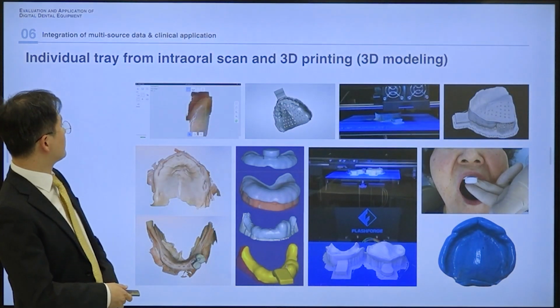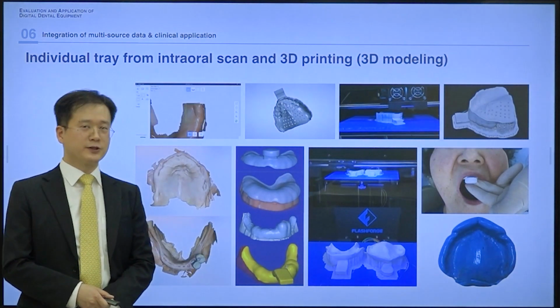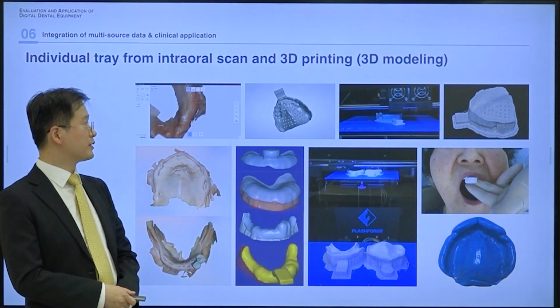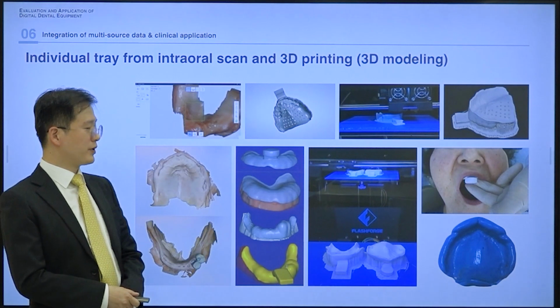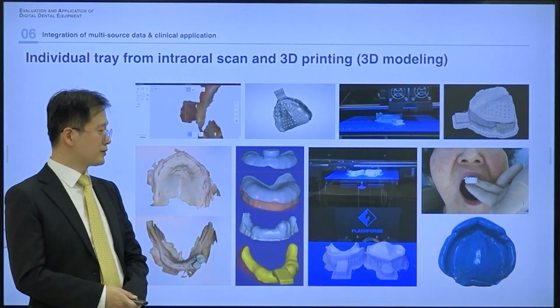We can utilize intraoral scan data to fabricate an individual tray and print it out and make a denture impression.